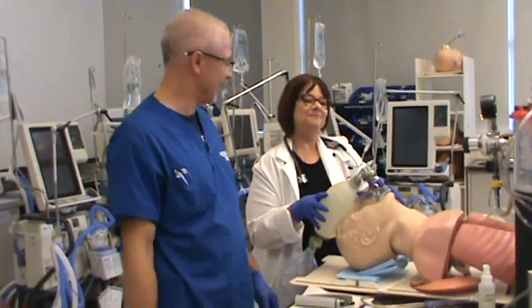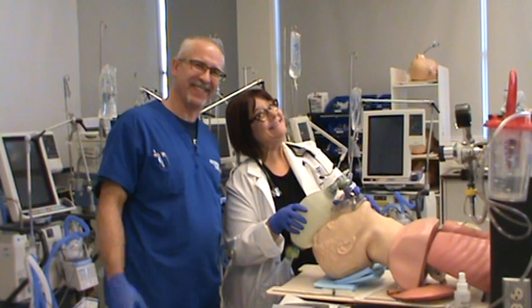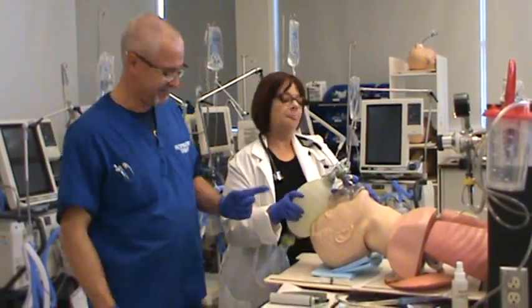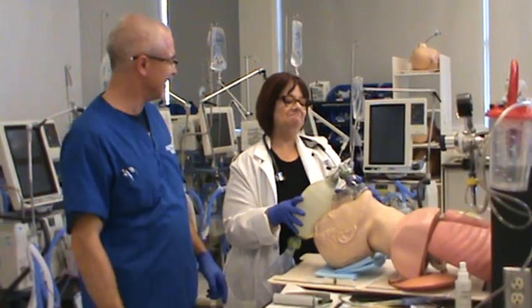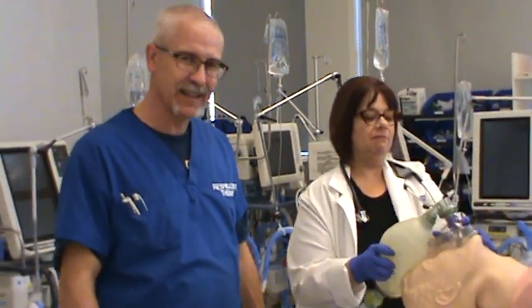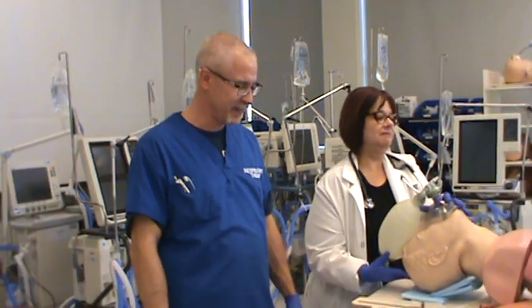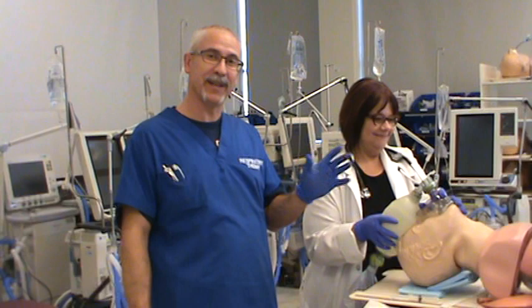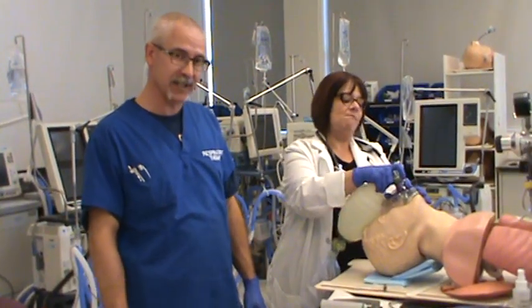Thanks Cliff, and welcome back everyone. It's Diane, myself, and Cliff offering the camera. This is the 6th in the intubation video series we're doing for you. You have a chance to observe this at home and probably chuckle about it more than anything. What we're going to be doing now is putting the endotracheal tube into the patient.